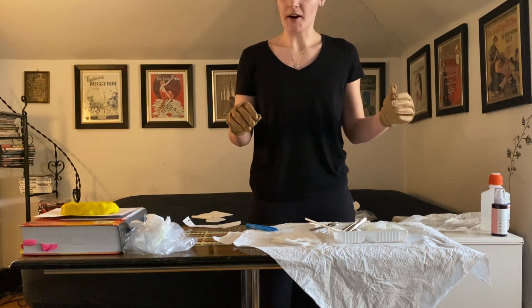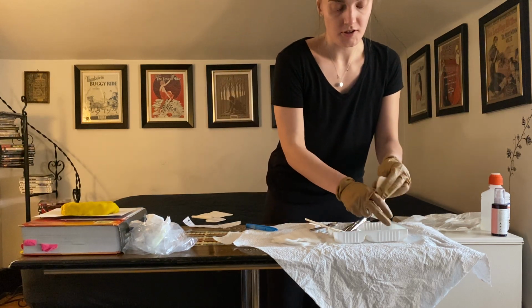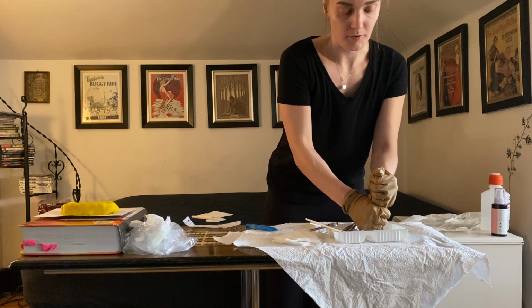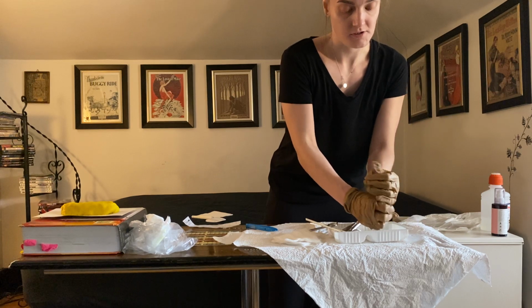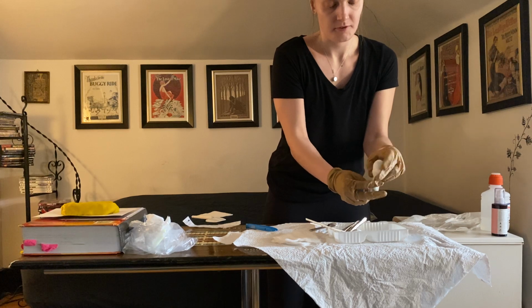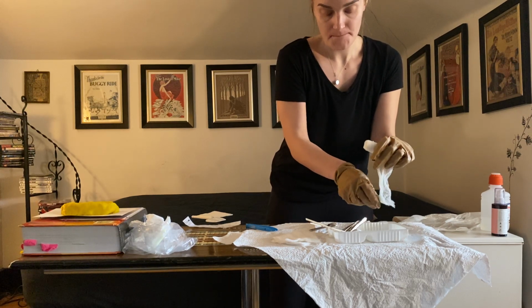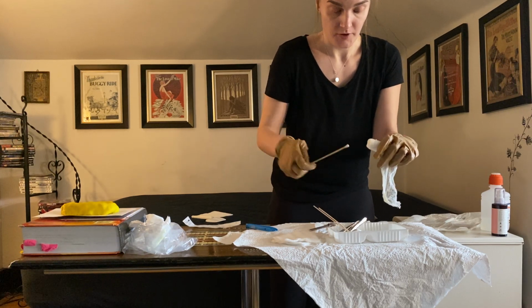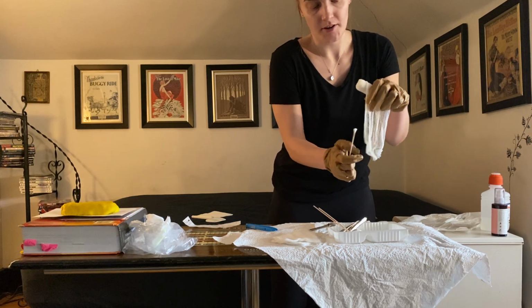Okay, so now I need to start packing. So I'm going to pack with the Curlix here. So I have it saturated in the normal saline, so I need to drain that out. Just being very, very mindful because I don't want to get any drops outside the tray. Okay. And again. So I've been very mindful not to get any drops outside the tray. So now I can start packing.